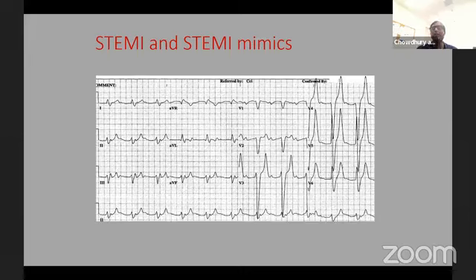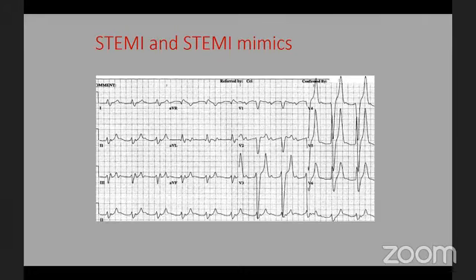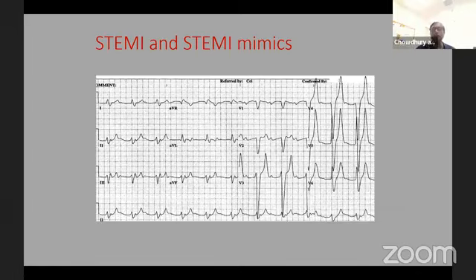What is the diagnosis on this patient? Coming with, let's say, a 55-year-old. Everybody is 55-year-old. Everybody is male. Everybody is diabetic, hypertensive. This patient comes in with this EKG. What is the diagnosis? Sir, we have to check the potassium level of this patient. Yes. And also, thank you, Tushar, you got this right away.